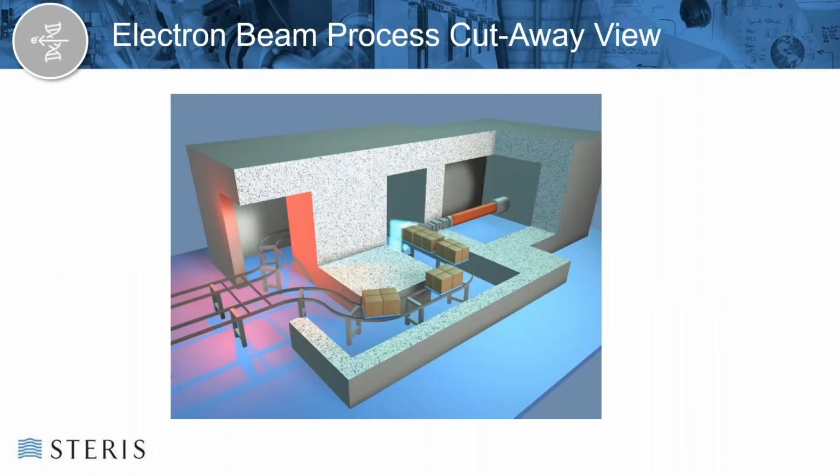As far as shielding goes, you can see a cutaway of shielding here. We wouldn't normally ever be able to turn on a process that looks like what you see in this picture. This picture has a cutaway of the shielding just so you can see inside. You can see that the amount of shielding here might be sufficient for the type of source that we have.